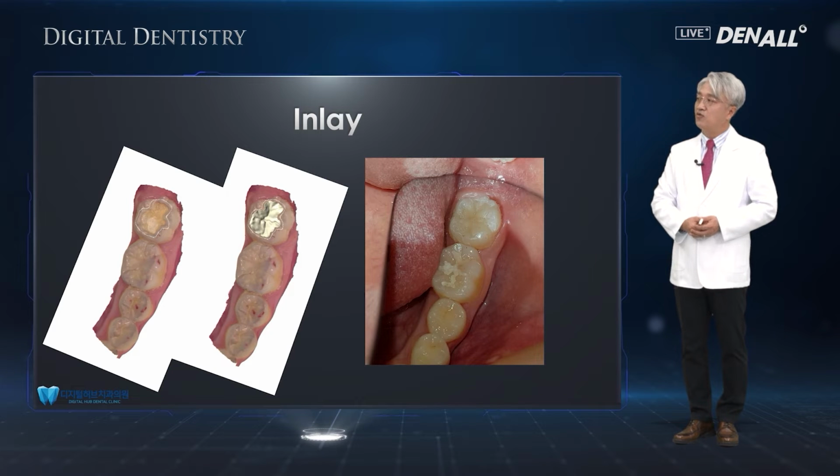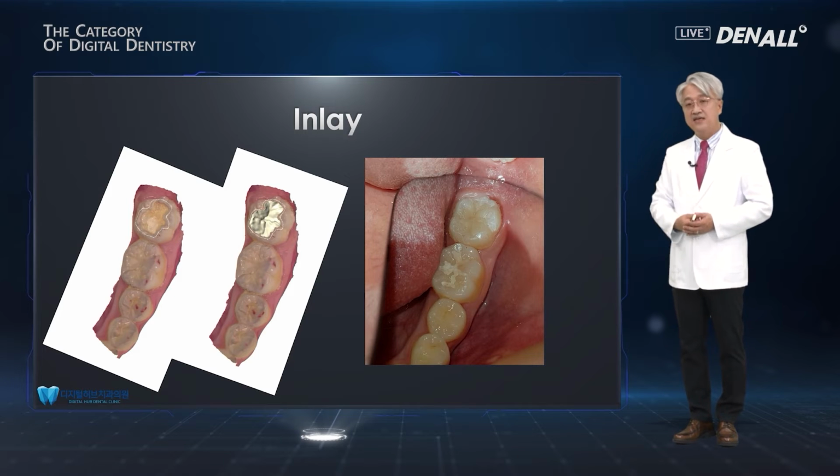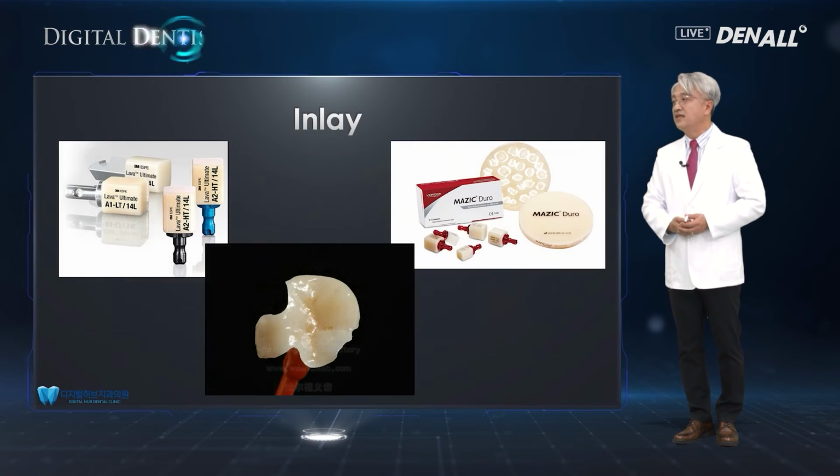So number 37, it fits well, and as an inlay, it's something that I always recommend to be the first treatment to use with CAD/CAM if you are just starting off, because it's very easy to do compared to other things. So please, I recommend you start digital dentistry with inlay.